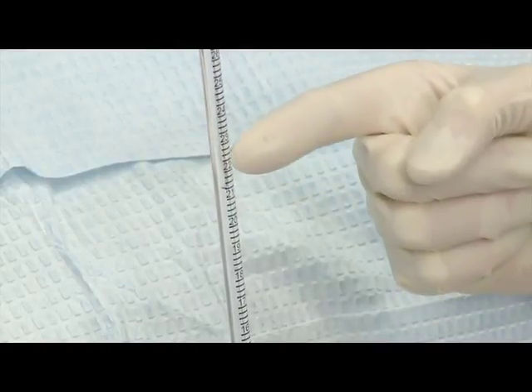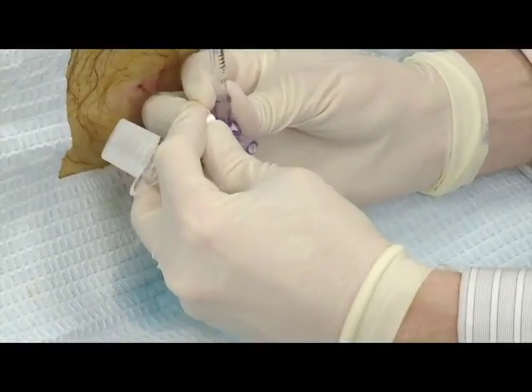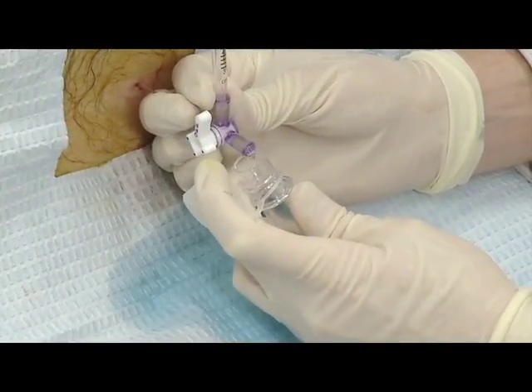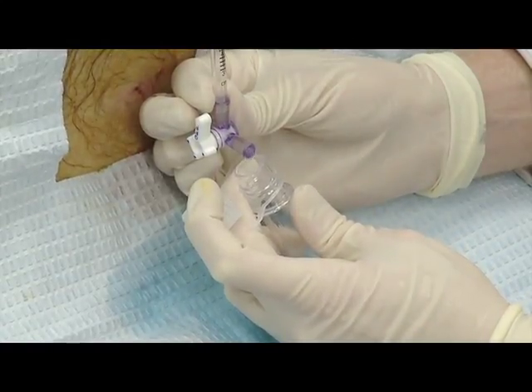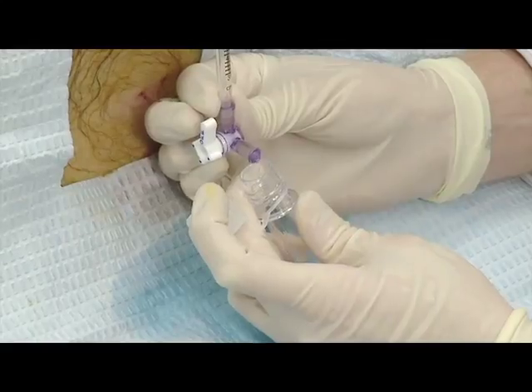Once the column of fluid stops rising and the measurement is noted, rotate the stopcock valve to allow the CSF in the manometer to drip into the first collection tube, which should be held beneath the manometer to catch the CSF that will be initially expelled from the device.